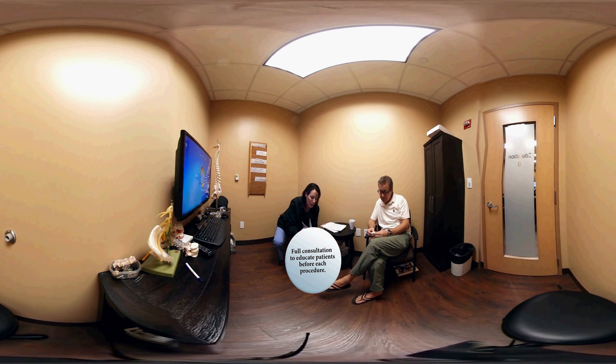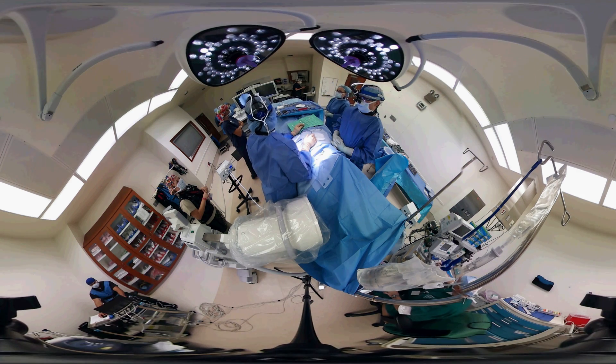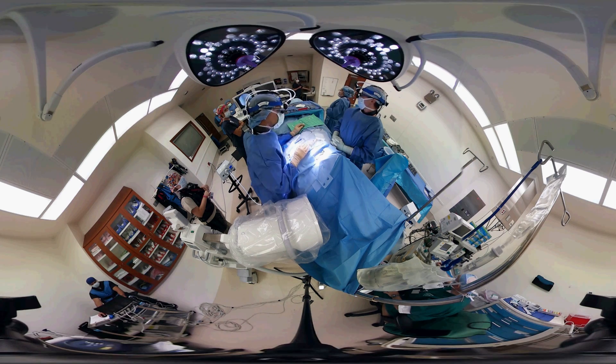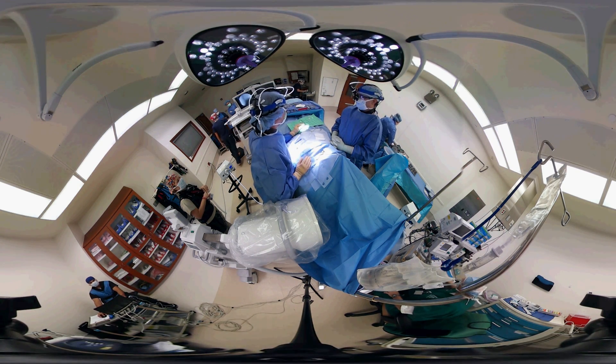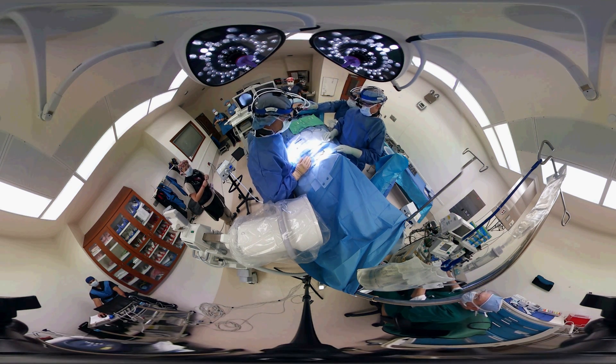Each patient, after I speak to them, will also go through an educational process where they'll sit down with one of our nurses to make certain they have a clear understanding of the surgery itself. Once we're in the OR, we have the patient totally draped out so the only thing that we see is a small area of the skin where we will make our incision. The head is to the right of your screen and the feet are towards the top of the screen.